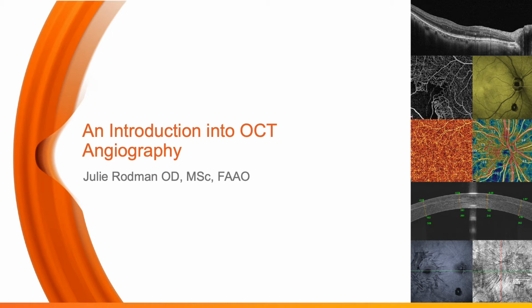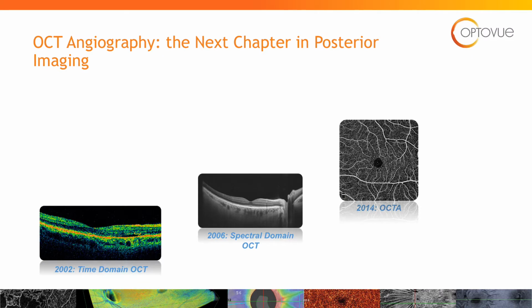I'm Dr. Julie Rodman. It's my pleasure to share my experience and passion for this technology with you. In order to understand OCT angiography, you have to have a little bit of history behind where we have been with OCT and where we are now.